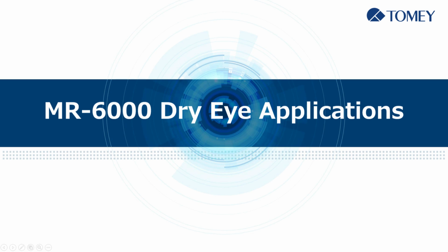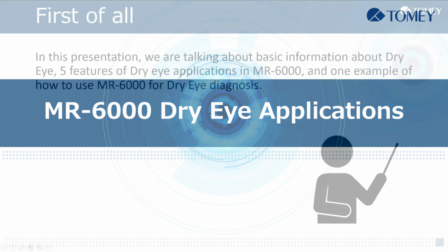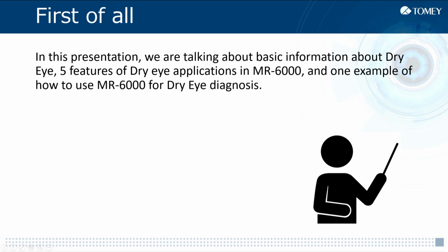From now, I would like to talk about new functions of MR6000 dry eye applications. In this presentation, I am going to talk about basic information of 5 features of dry eye applications in MR6000 and some usage examples.